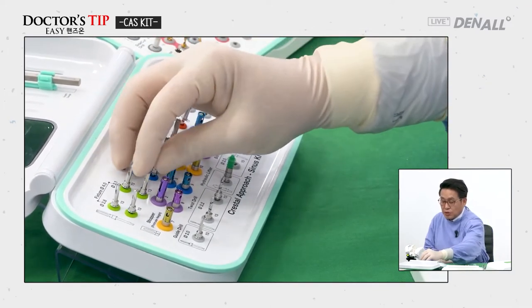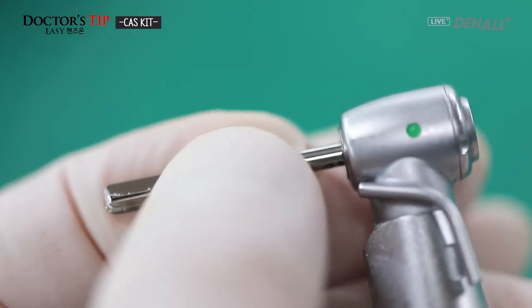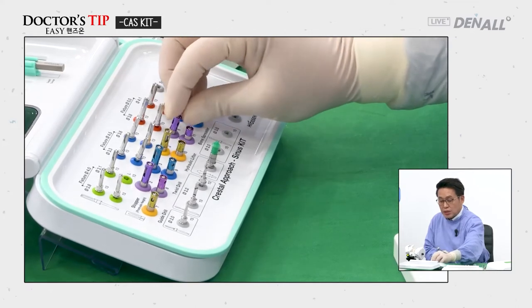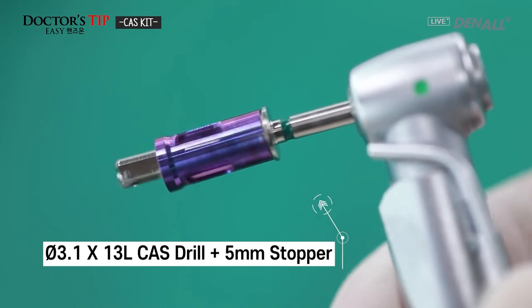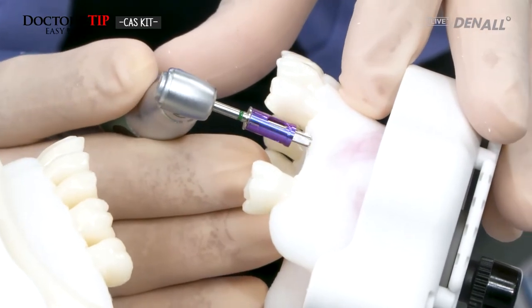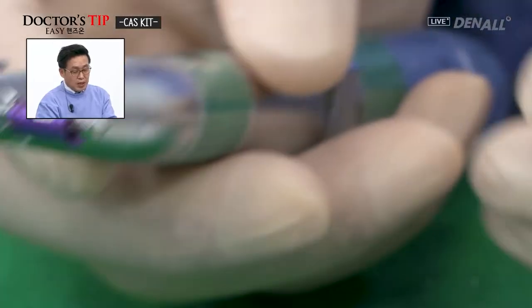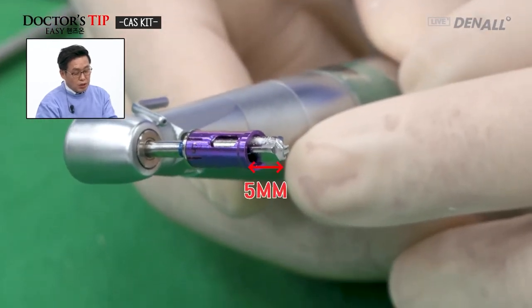CAS drill, diameter 3.1, is chosen. Using method 3 that I explained, 1 millimeter advance will be made, so a 5 millimeter stopper is connected. The residual bone height is 5 millimeters, so the 5 millimeter stopper is connected to the CAS drill.